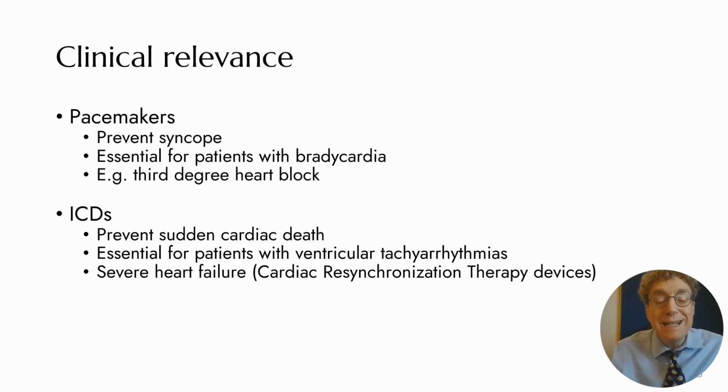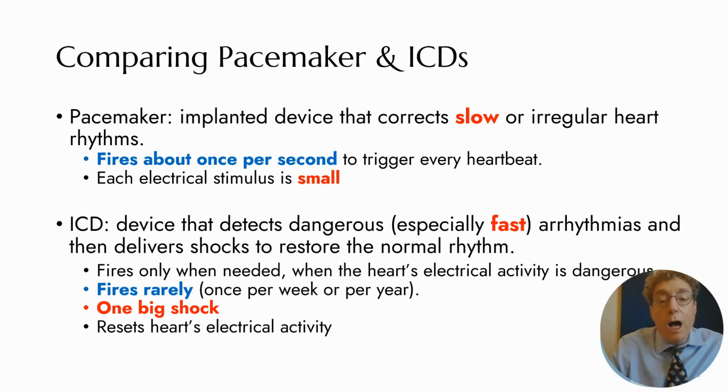So ICDs or defibrillation is essential for patients with ventricular tachyarrhythmias, that is fast heart rates, very fast heart rates, or risks of very fast heart rates, for example, above 200 beats per minute. And it's also important for patients with severe heart failure. And this would be called cardiac resynchronization therapy devices.